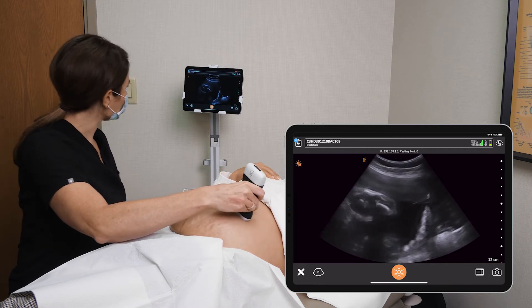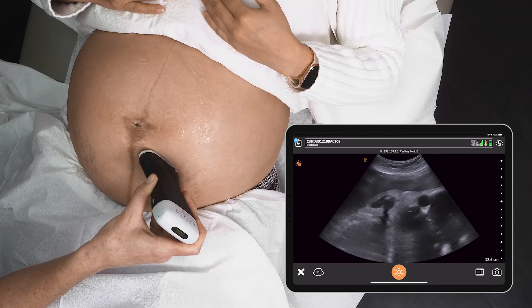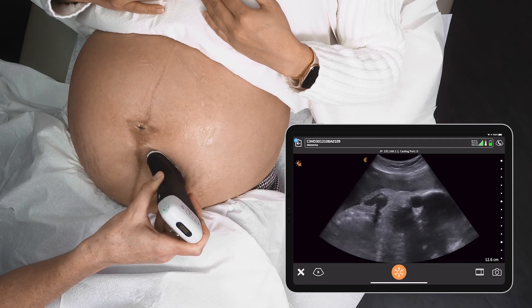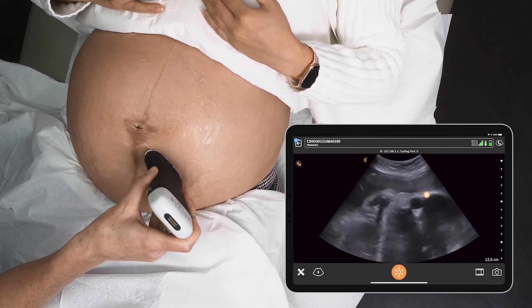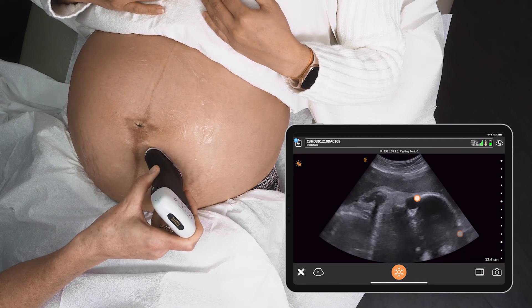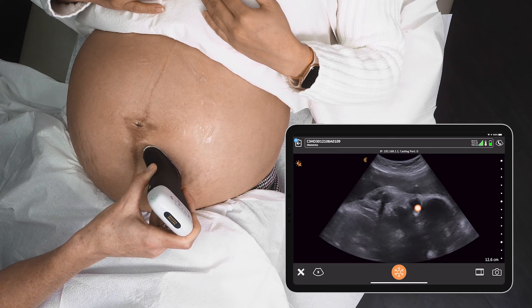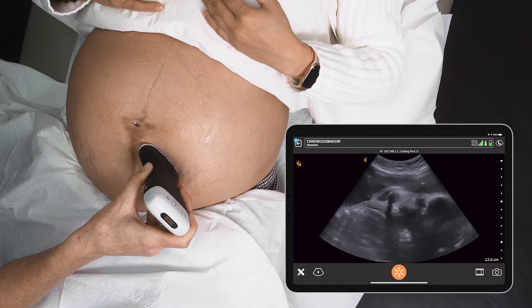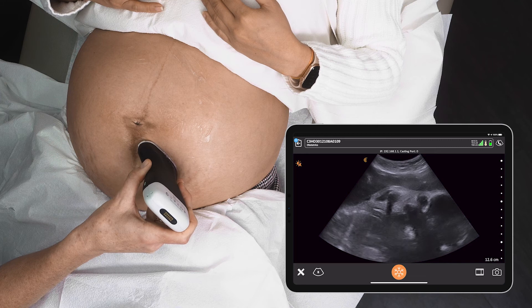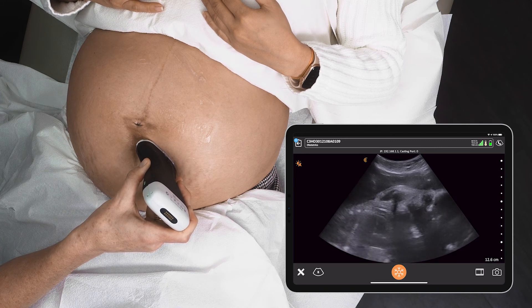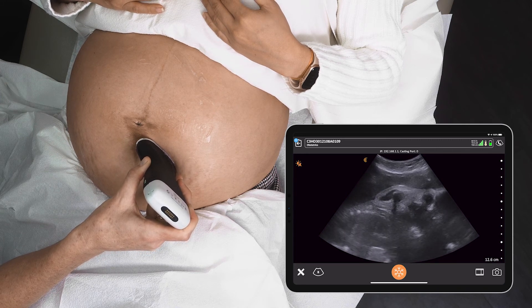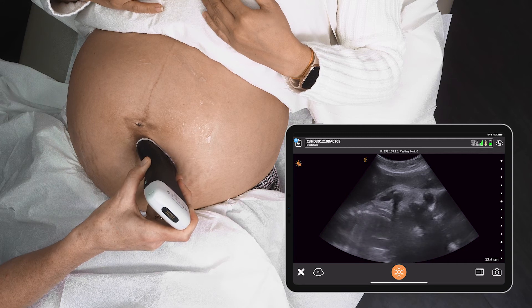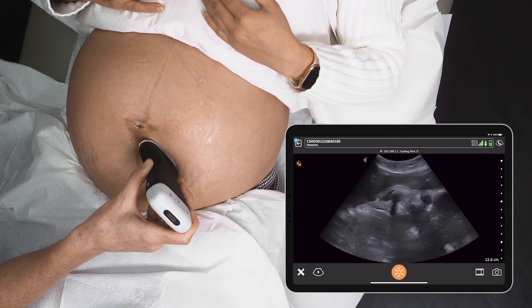Let's see if we can get this side of baby's face. Baby seems to have a hand up, but we can see the outline of the skull and that's baby's eye socket. You can see baby's mouth here — it looks like baby's drinking. And then the heart beating in the chest with a little hand up near the face. Very cute.